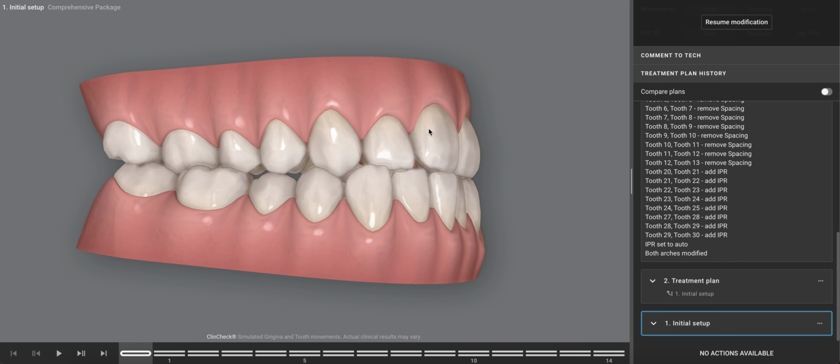So I hope that makes sense. I threw a lot out there, mutually protected occlusion, as a way for us to think through what the ideal is. If we're not going to get there, what are the compromises that are going to be made?